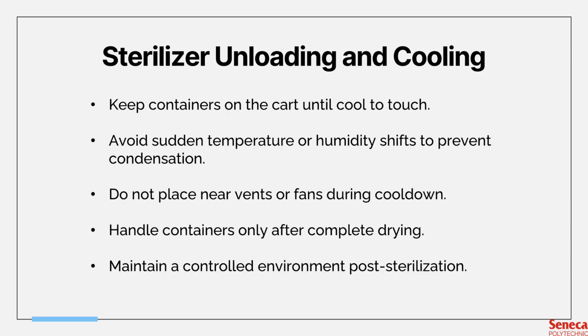If condensation forms, it means moisture has entered the set. That container is no longer considered sterile because it's a wet pack. So you only handle once the load is fully dry and cool to the touch. Moving hot containers can actually distort the gasket, especially with really heavy instruments within containers. And it can also compromise the seals and handles. So cooling in a controlled environment post-sterilization preserves the seal and integrity of the container and sterility of the instruments.